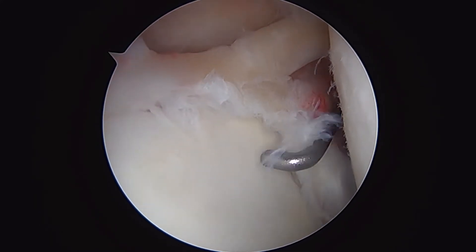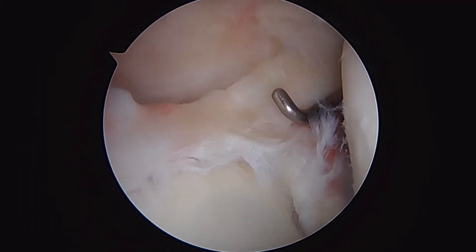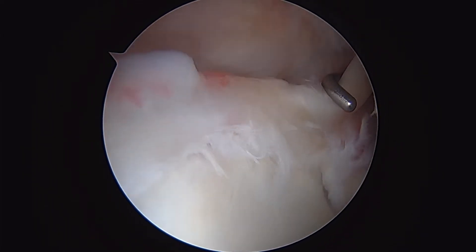This is a SLAP tear — superior labrum anterior to posterior — involving this attachment here of the long-headed biceps tendon onto the superior labrum in the shoulder.